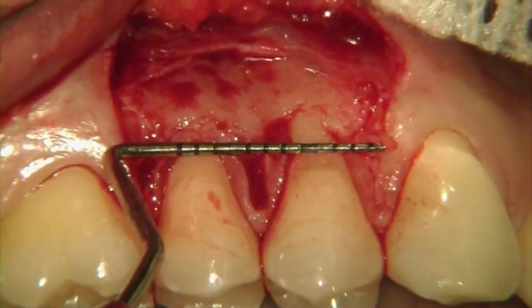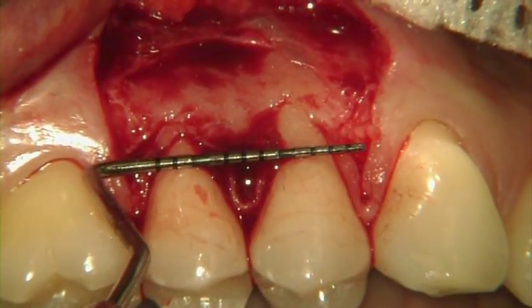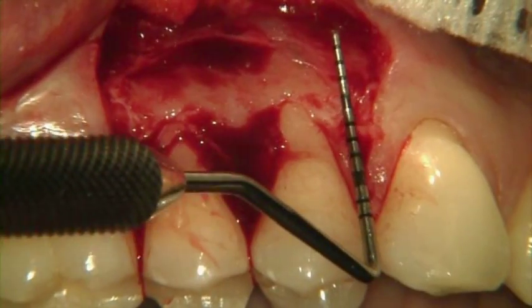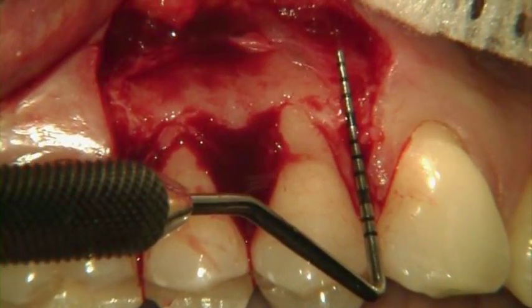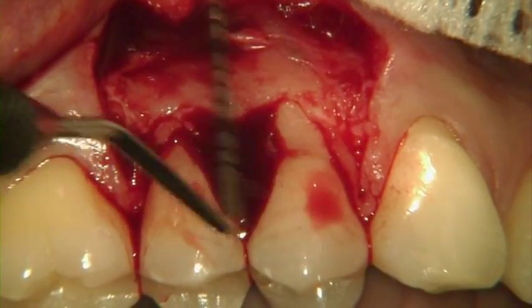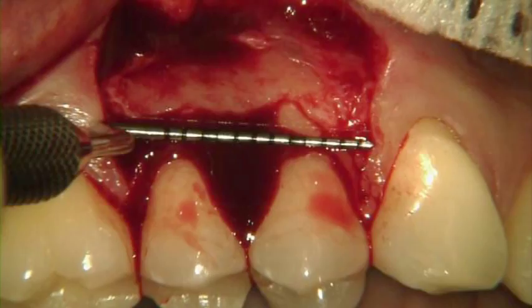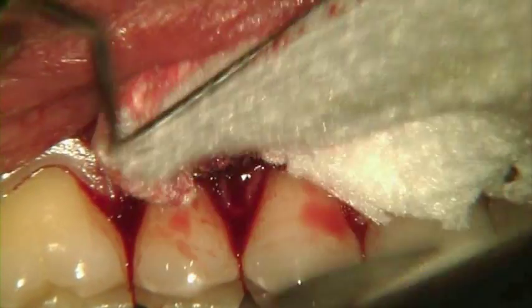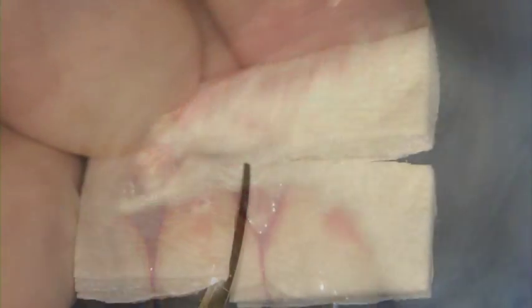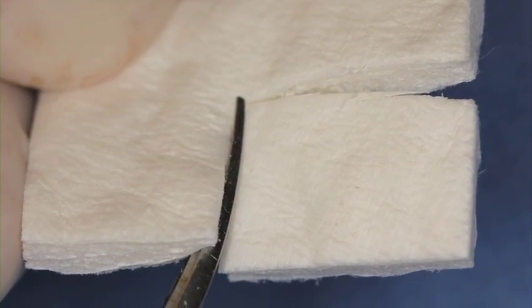Proper sizing and preparation of Mucograft collagen matrix is critical to a successful result. Please refer to the full prescribing information contained in the package insert before using the product. Using a UNC periodontal probe, the surgeon measures both the width and height dimensional requirements necessary for placing the graft material. Next, Mucograft is shaped to cover the exposed root surfaces.